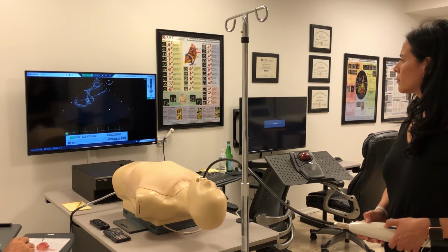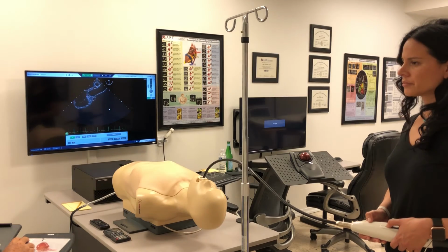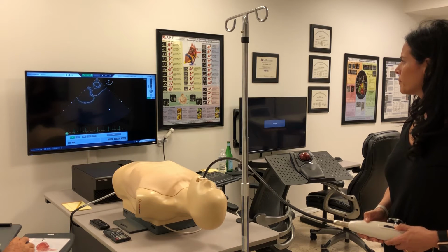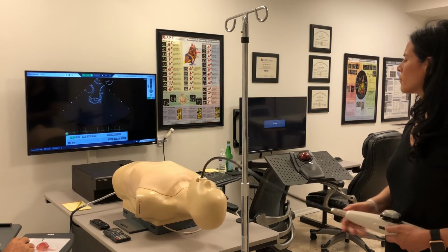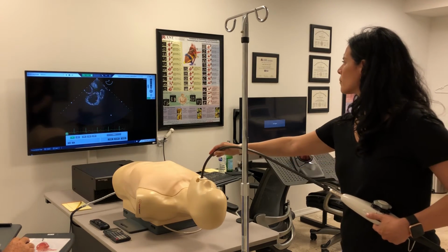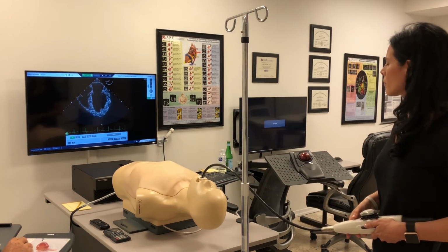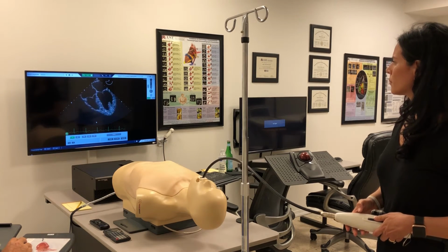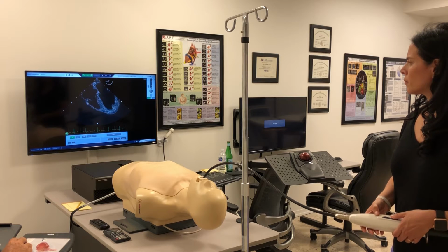So the way I'd recommend developing the bicaval view, which by the way is a very easy view to get in TEE, one of the easiest views, is to go to the home view at 0 degrees of omniplane and find the level with the left atria, with a nice robust left atria. You're up in the great vessel, so you'll have to push in a little bit. Good. And then you want to find that part of the interatrial septum that has the fossa ovalis, and you'll know it because it will be thinner than what you're seeing now, which is the limbus.